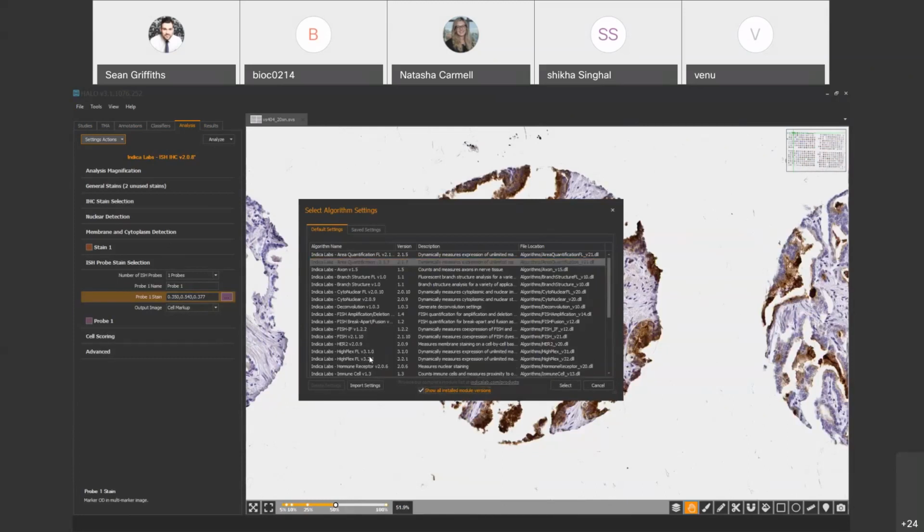You'll see here I've got two versions of HiPlex. But if you want a cleaner looking list and you want to be drawn just to the most recent and therefore least buggy, most advanced functions module, then just leave that unchecked. When new users come to the software, and I suspect there'll be a lot of new users here based on the number of attendees, leave this unchecked so that new users come along to use the most recent versions. It'd only be if you had a requirement for consistency with a legacy version of the module that you would probably check this. So let's select area quant and hit the button down here to open the module.